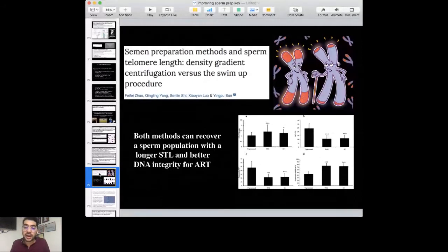That sample will not have any kind of good DNA sperms left, because you've actually had almost a 6 hour waiting period. And this is a scenario which is very common in most laboratories, because we're burdened with so many patients that we can't really cater to these needs as well. So always understand that in such a scenario, doing an IUI within that 90 minute window is essential, right?